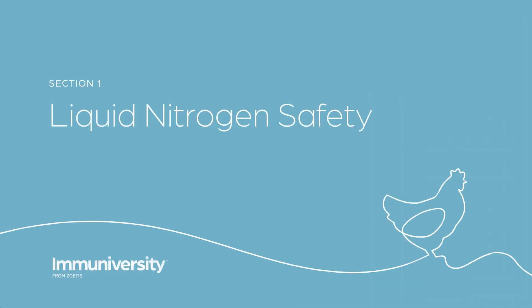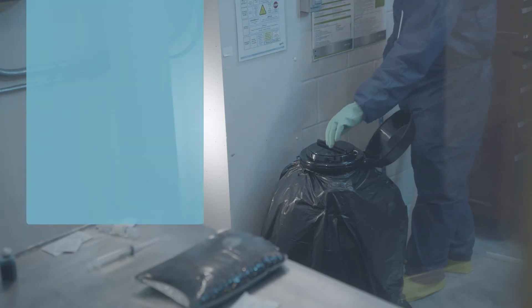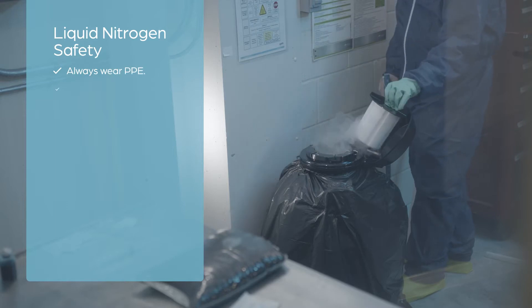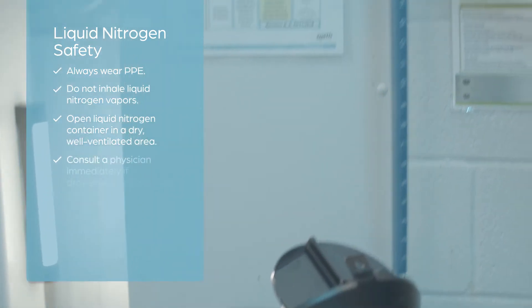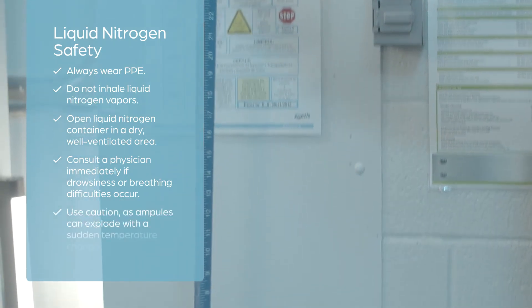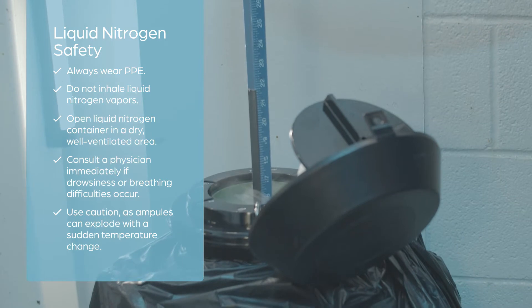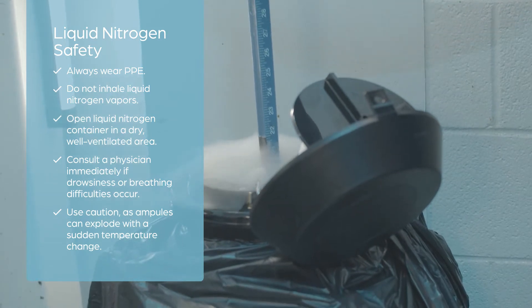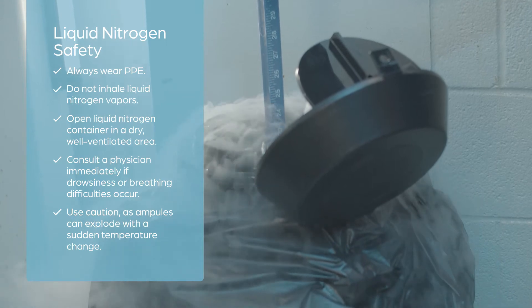Frozen cell-associated vaccines are stored in liquid nitrogen until ready for use. Take precautions when handling vaccines in liquid nitrogen. It's important to check liquid nitrogen levels daily. If nitrogen levels in the large Dewar flasks are less than 3 inches (7.5 centimeters), contact your supplier.